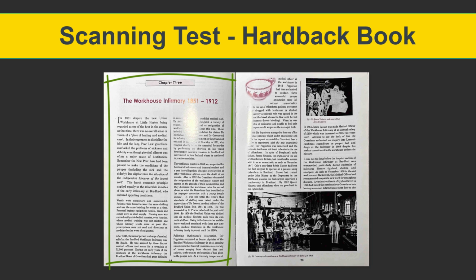I then tried scanning one page of the book at a time. This time the OrCam did better. Again, it had no problem with the first page, other than the drop cap, but with the second page I was able to read some of the text that was wrapped around the image, and it read all of the text. It also read out the captions underneath each image.